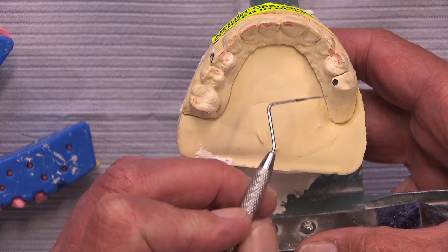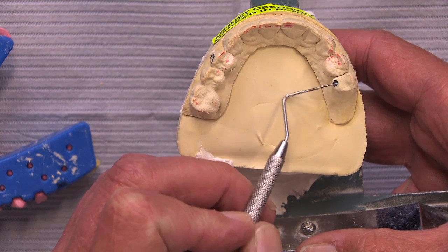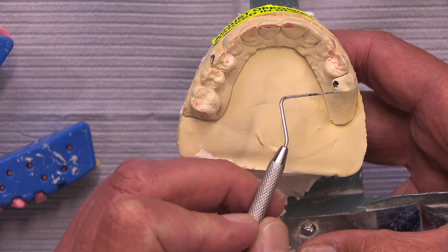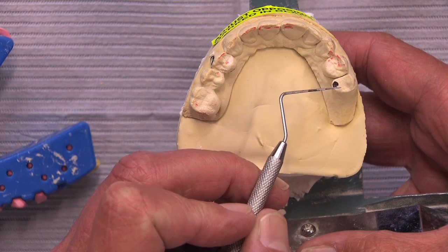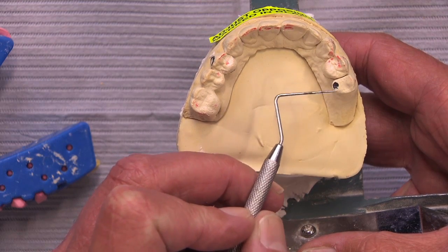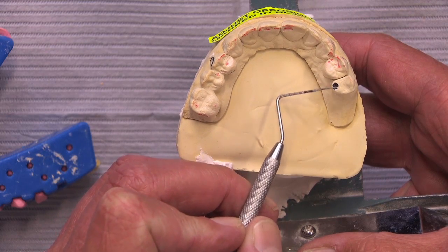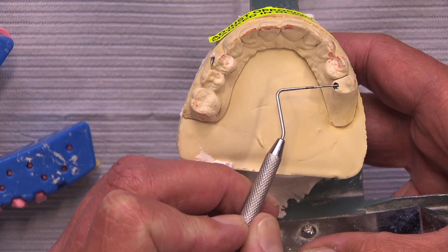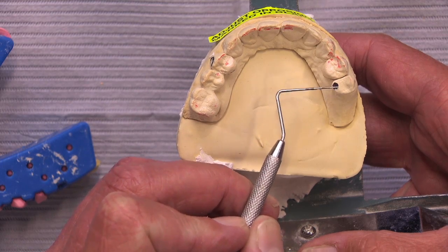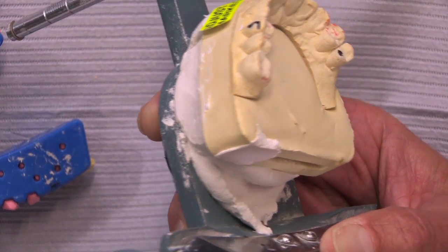The best way to teach technicians this is to get them in the chair, and when you do a crown on them and then go to adjust their opposing and they reach out and grab your arm and say, no, in slow motion like in the movies, because they don't want their opposing, maybe it's a natural tooth, ground on like this. It's a little different if it's a crown, or a little different if it's amalgam or something like that. So I caution them, please be very conservative when you come in and adjust this opposing dentition. So you can see that's a pretty small circle here. If you look at it, it's not like we have a huge flat spot that wasn't there before. It was just kind of pointy.